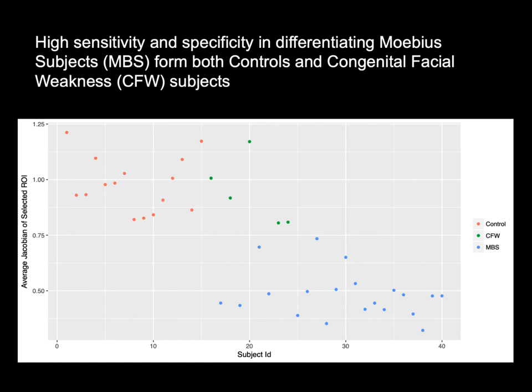But not really, because you get a certain deformation, and then you have a value of the Jacobian that is associated to that deformation. But this is not dissimilar than what you have with FA, right? You compute your FA. So yeah, sure.